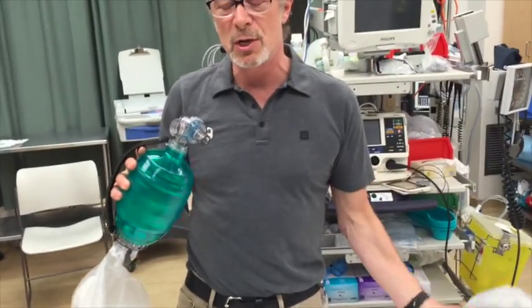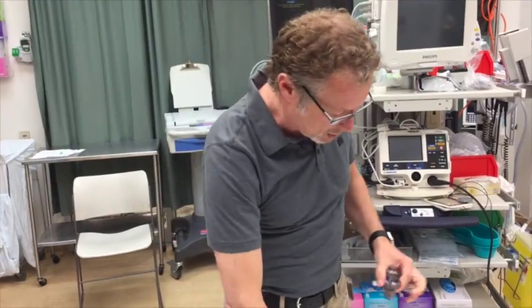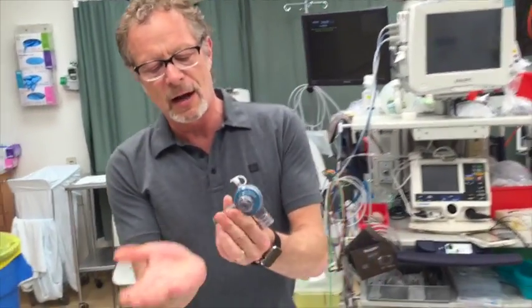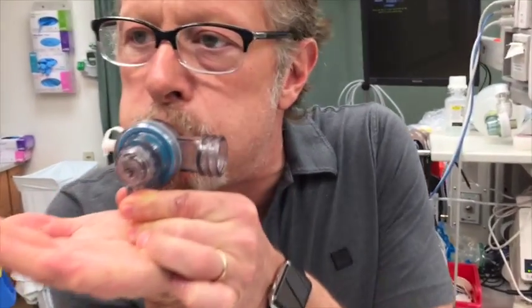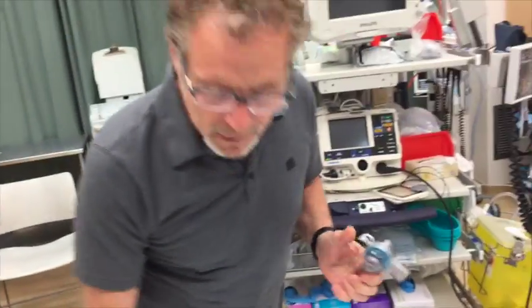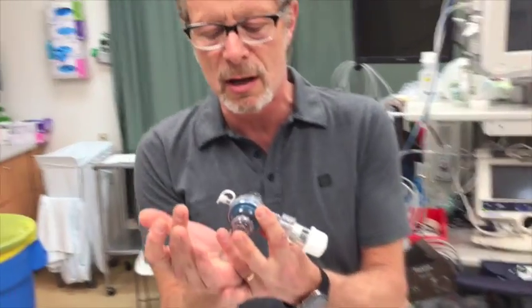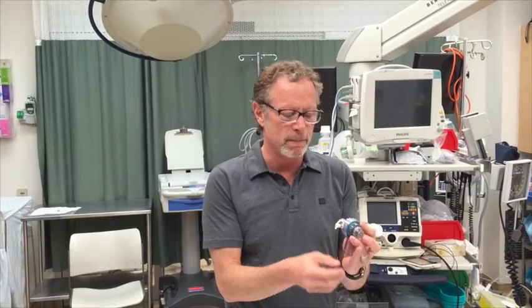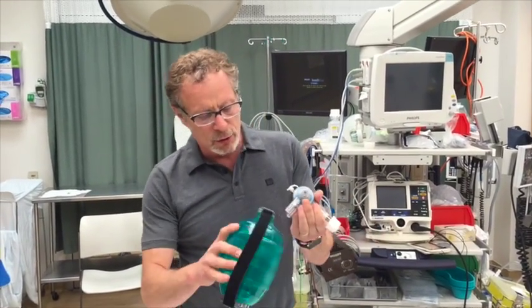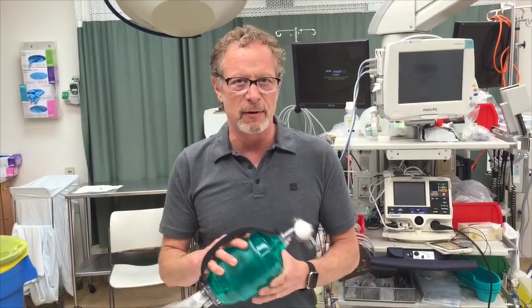The way to fix that is to convert this into a closed system. To prove the point: if I block this off, I'm breathing out through here but also breathing in through here — a potential source of dilution. If I put a PEEP valve on here — and I don't have to dial in PEEP — this now creates a closed system. It's only allowing expiration in one direction, and inflow can only come through the system.